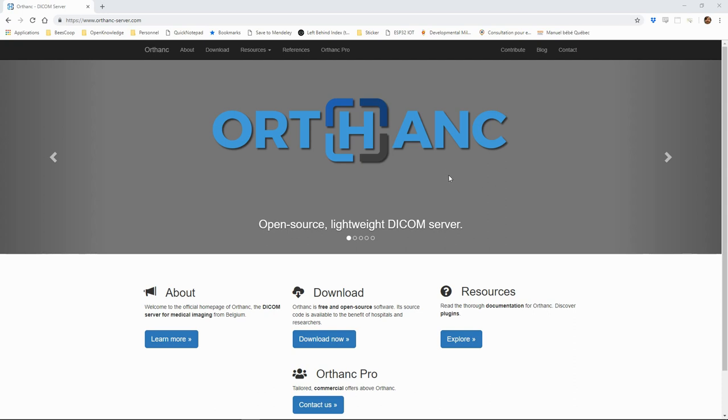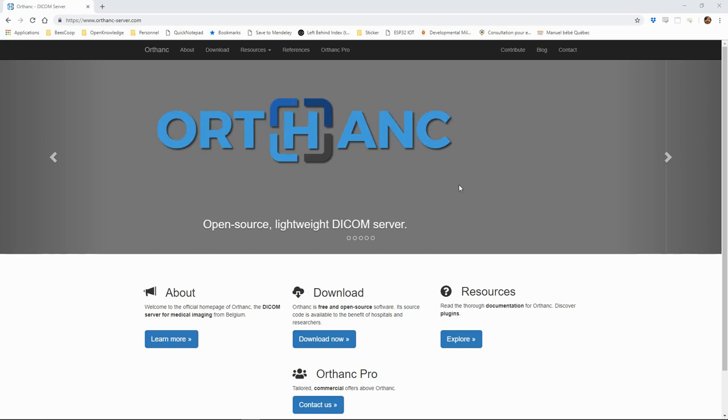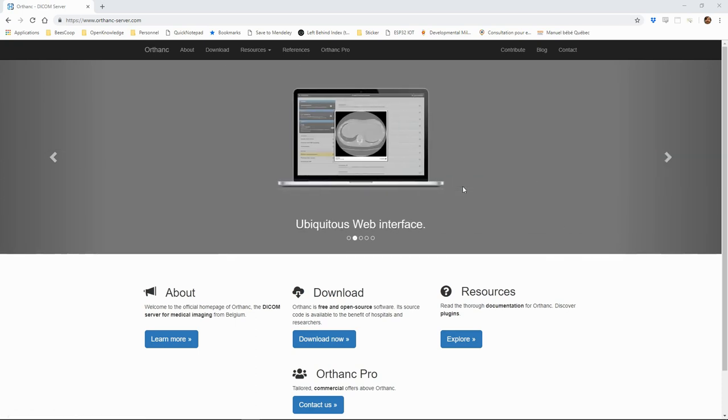Orthanc is an open-source DICOM server which is easy to install and provides a simple web-based user interface for browsing the data in containers.